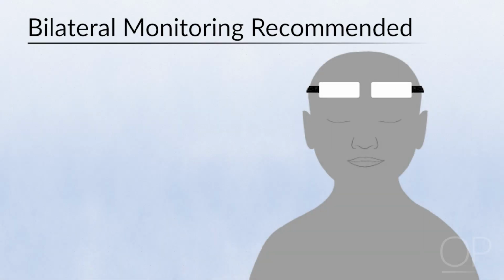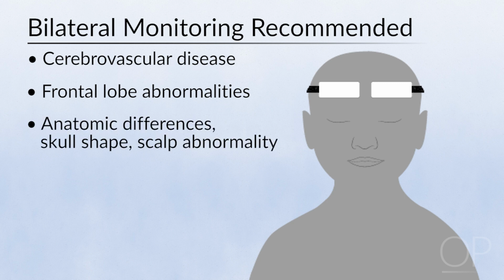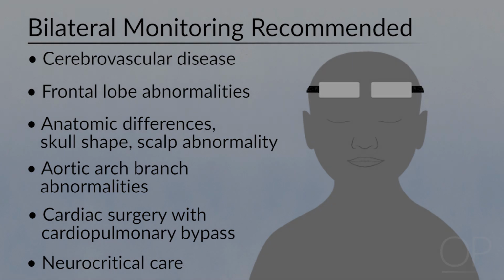I would recommend bilateral monitoring in patients with cerebrovascular disease, frontal lobe abnormalities such as a stroke or tumor, anatomic differences, whether it's in skull shape, scalp hematoma or swelling, aortic arch branch abnormalities, in patients undergoing cardiac surgery with cardiopulmonary bypass, and neurocritical care.